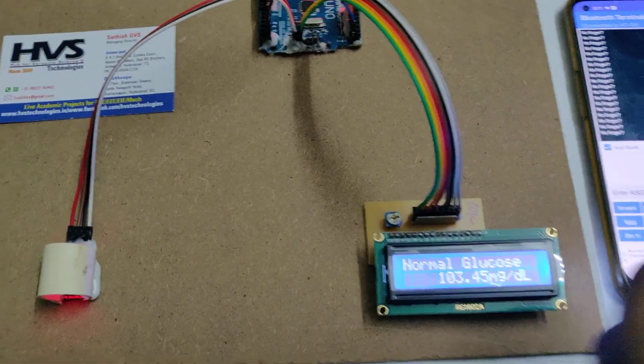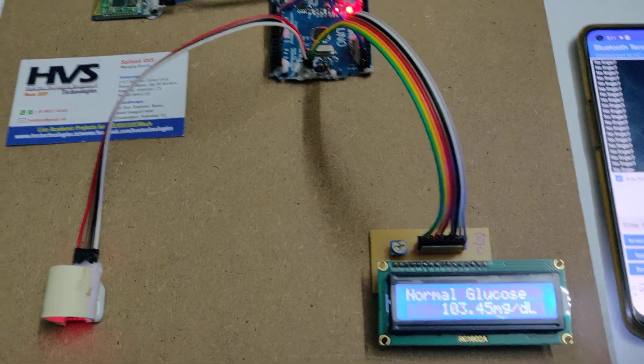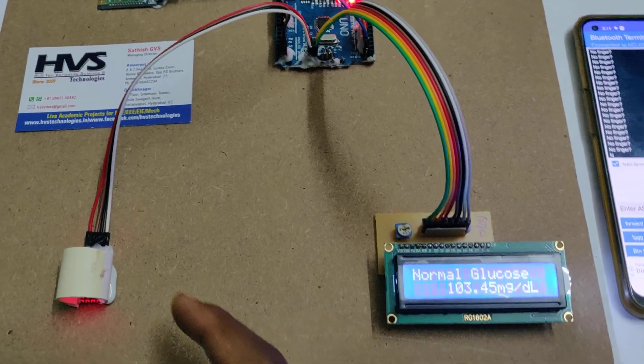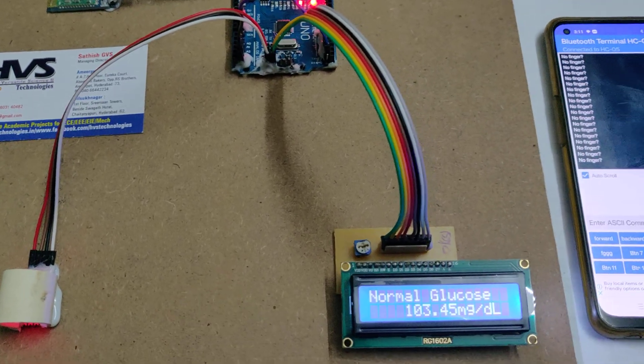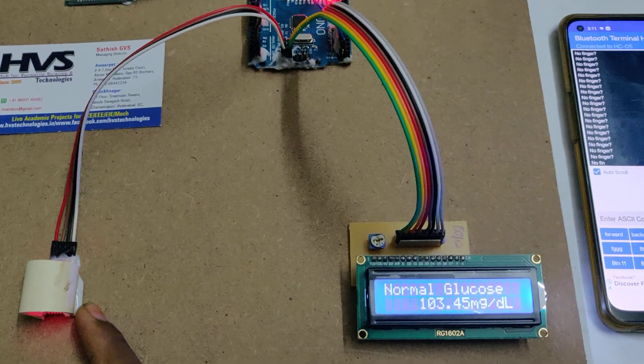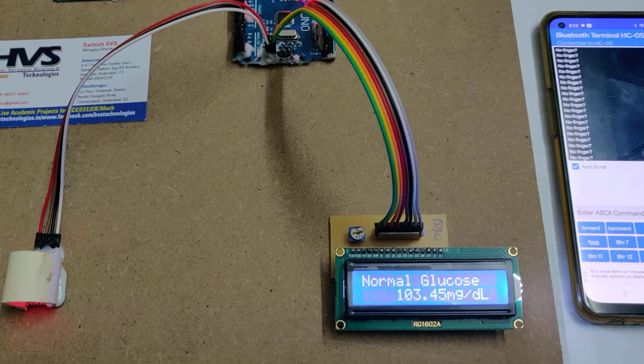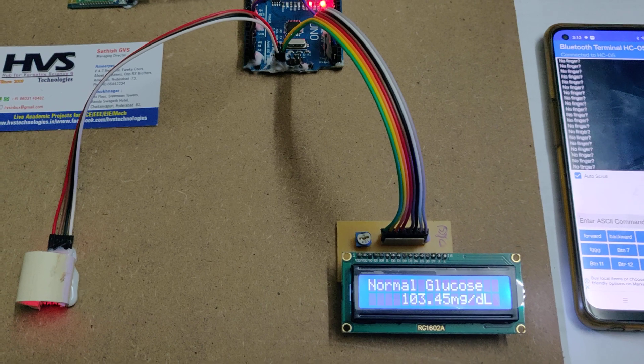We took real-time blood glucose level values from 20 to 35 members, then took the readings from the sensor and calibrated the density values coming from the sensor against the real-time values. From this calibration, we are getting the nearby approximate glucose values.